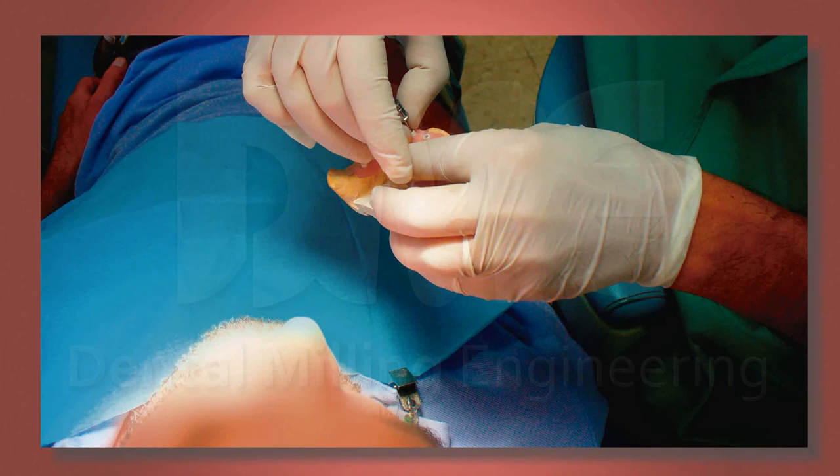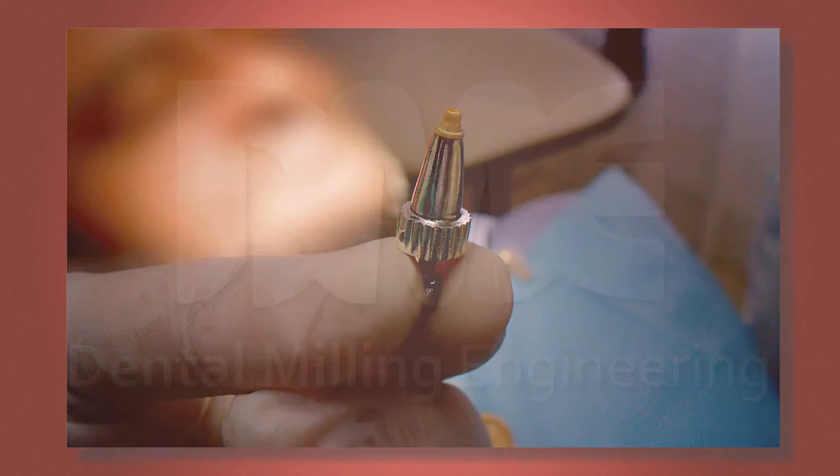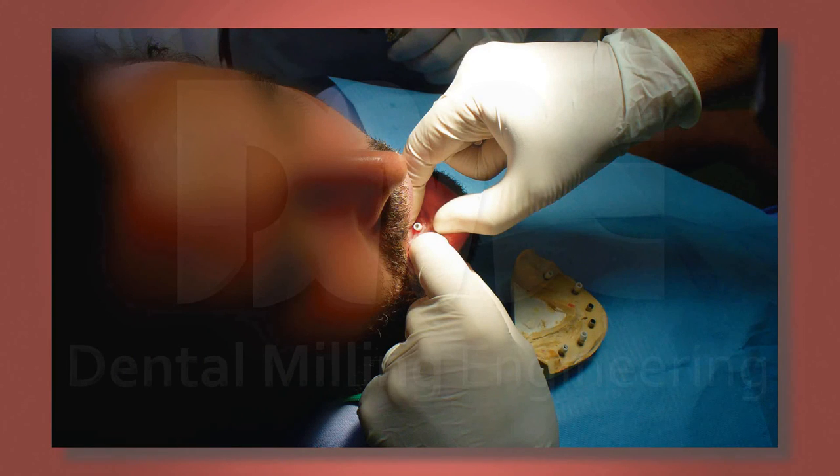As previously reported in our informational video, we proceed to remove the Zir-Lock from the model and place them into the mouth, one by one, with a corresponding converter and a screw, in the same position that the model shows. The converter is positioned to convert the internal connection of the implant into an external one. Remember that it is very important to take care with the positioning, respecting the correct angle that was taken into account by the laboratory when they initially started.